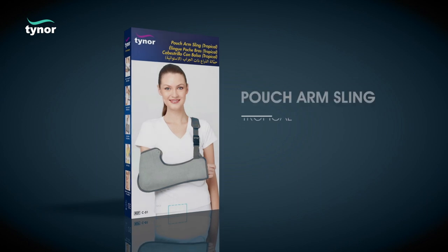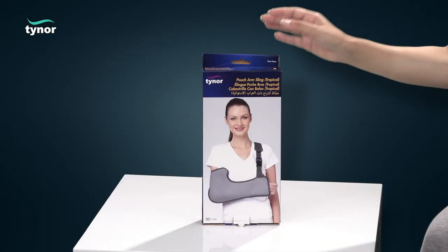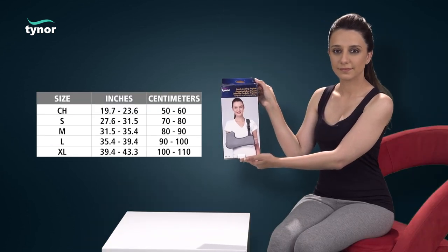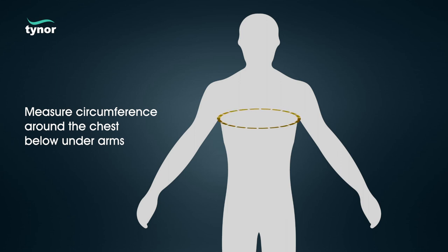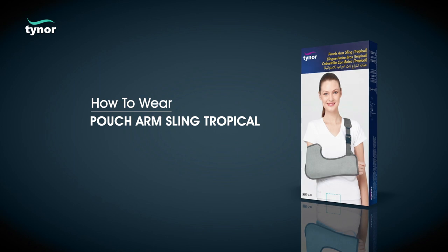Here we will discuss how to use the pouch arm sling tropical. The pouch arm sling tropical is available in these sizes. Measure circumference around the chest below the underarms. Now let us see how to wear the pouch arm sling tropical.